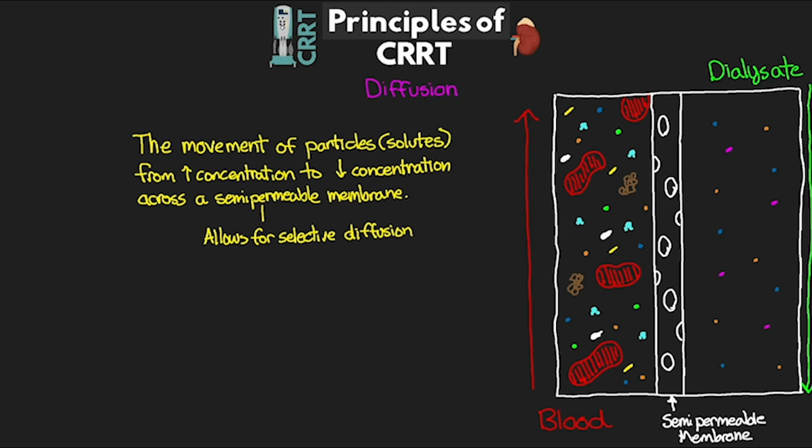Now, as I just mentioned, we have the blood and the dialysate flowing in countercurrent directions. The reason that we have this is that by having these flows going countercurrent, it's actually going to promote the continual clearance, and it does this by ensuring an adequate diffusion gradient is maintained the whole way through. So I know that sounds a little complicated, so let me illustrate that to help make the point.